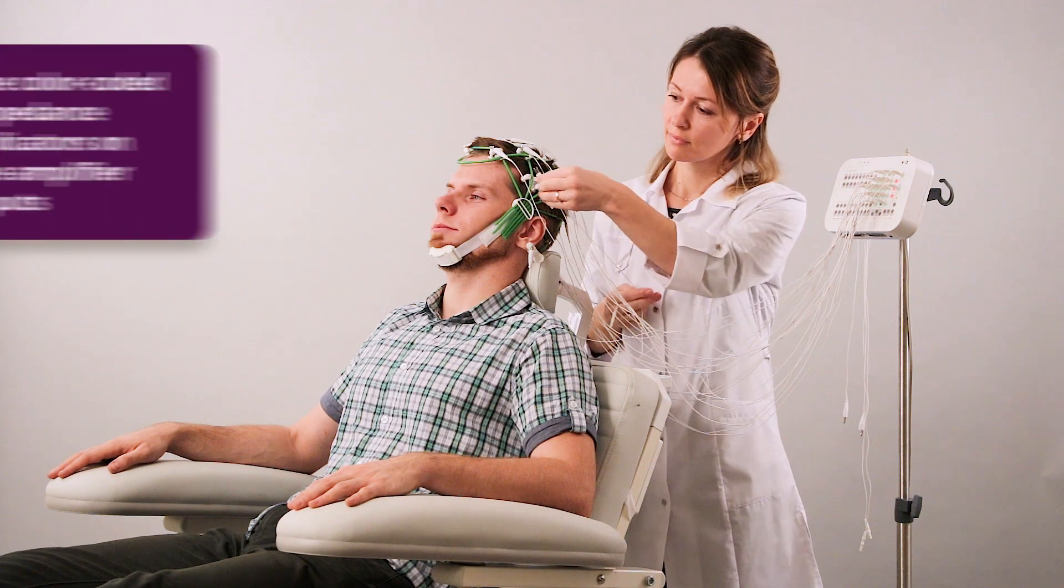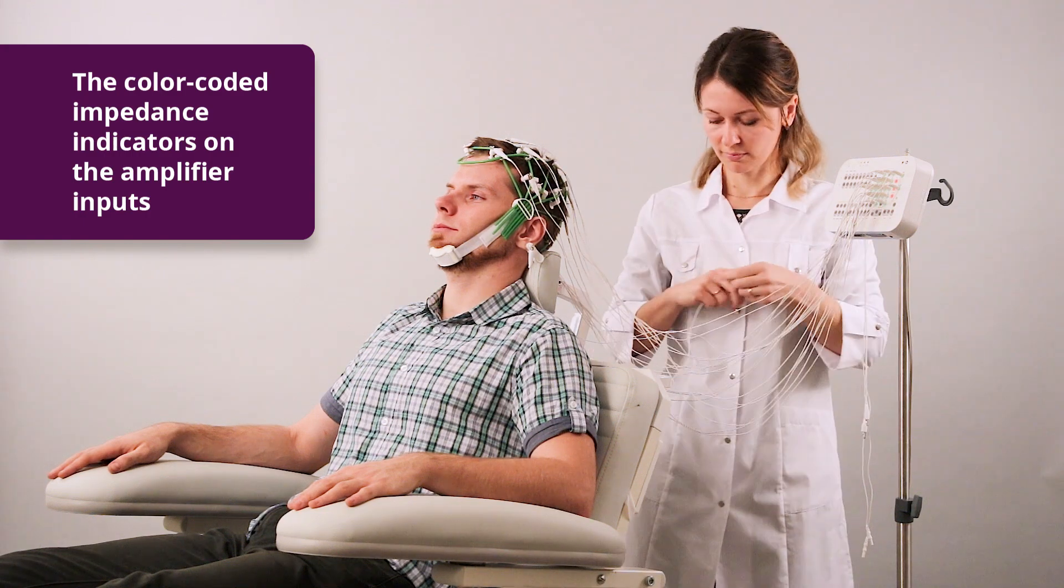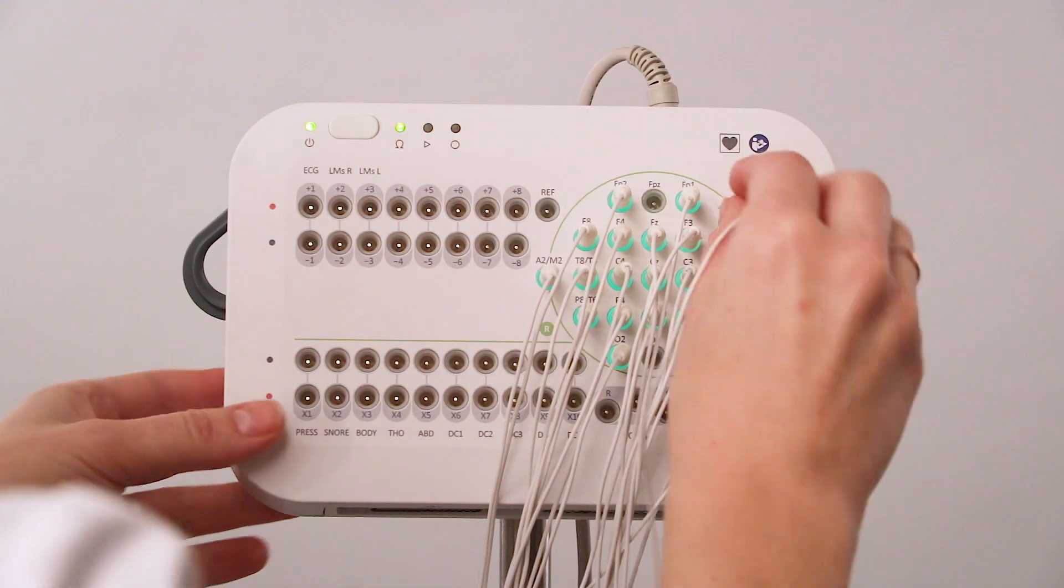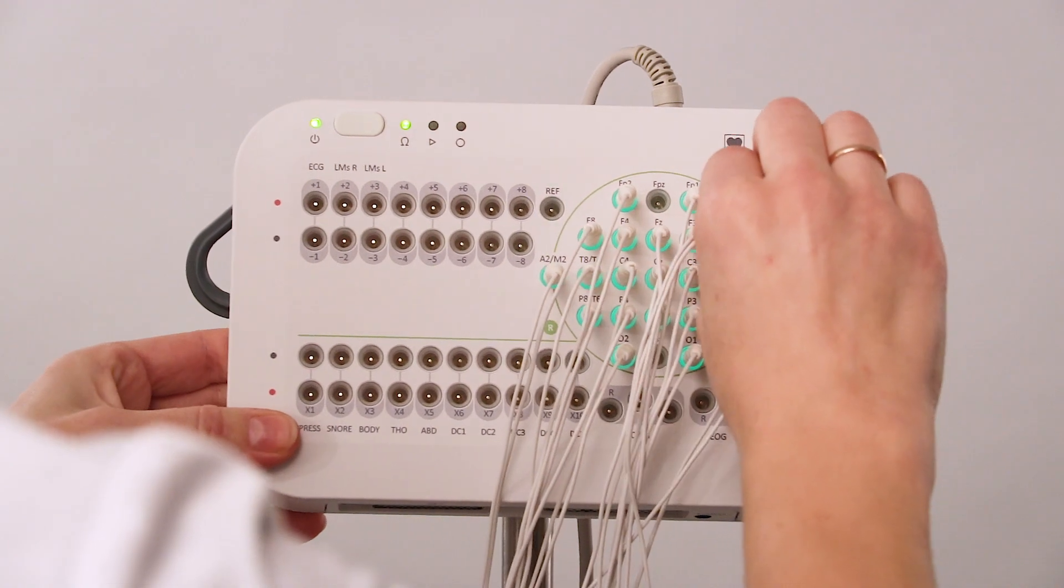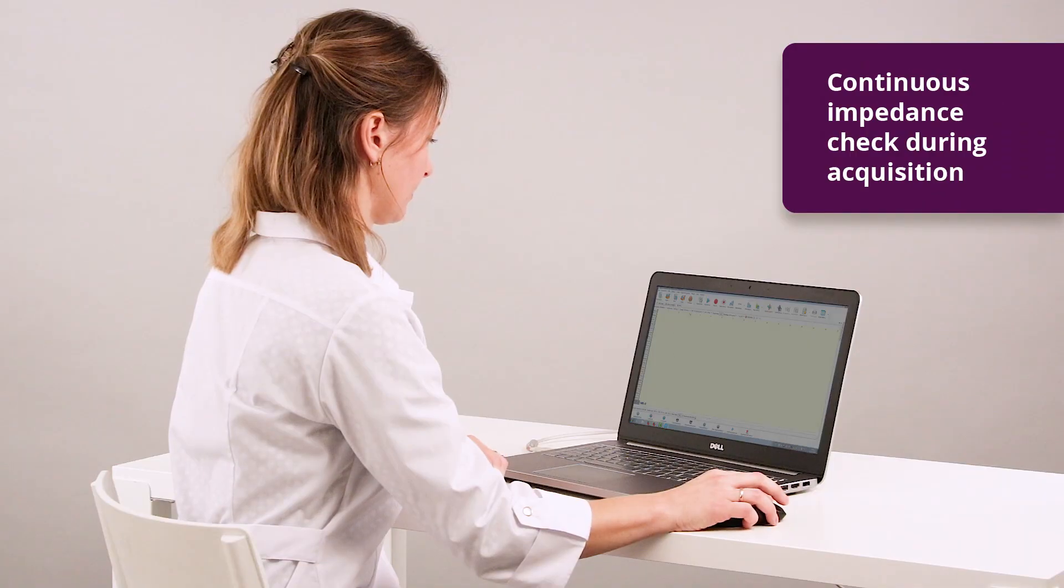The color-coded impedance indicators on the amplifier inputs help the specialist to assess the impedance quality during the acquisition and reposition the electrodes if necessary.